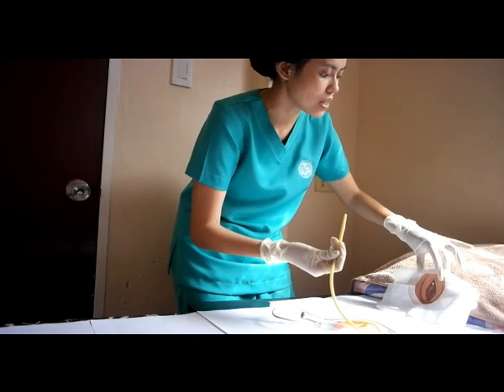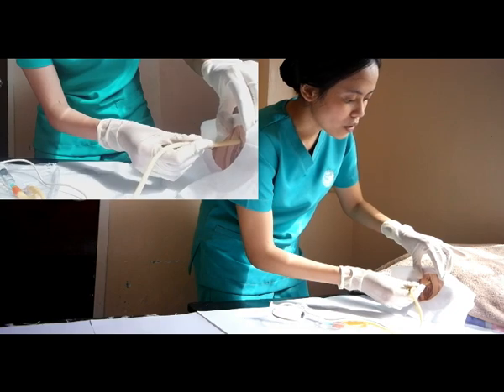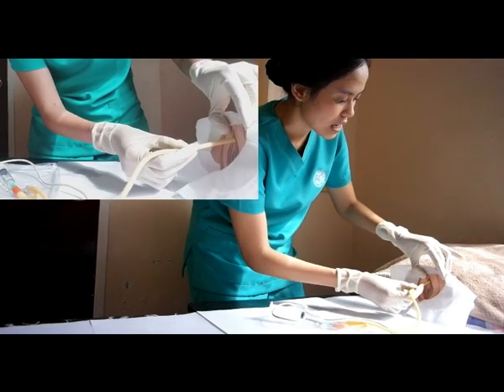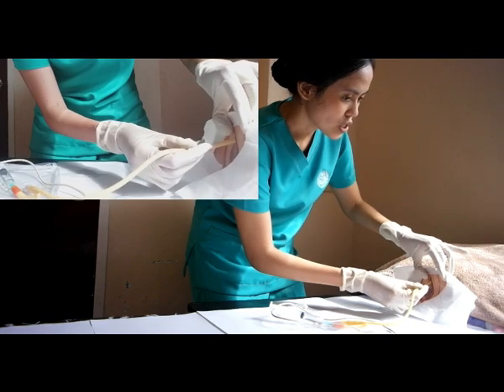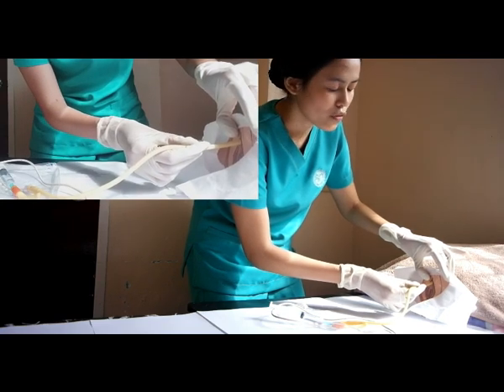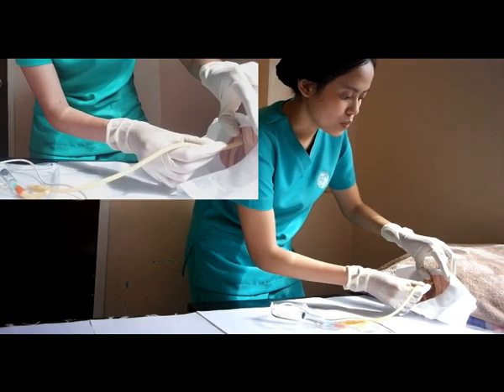So ma'am, can we inhale, exhale po? So we're going to insert that at the urethra. And you will be feeling resistance, and that's okay. We will just continually instruct the patient to inhale and exhale. Exhale po. Like that. So after inserting around 3 to 4 inches, and you have observed a urine flow, that's the time that we will further advance around 1 to 2 inches to properly anchor the balloon.